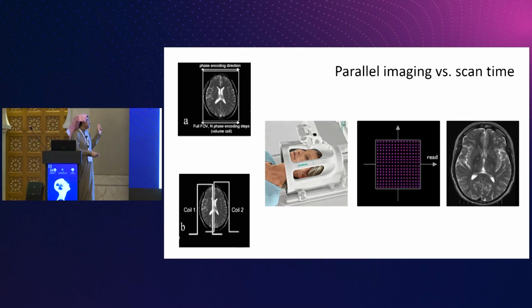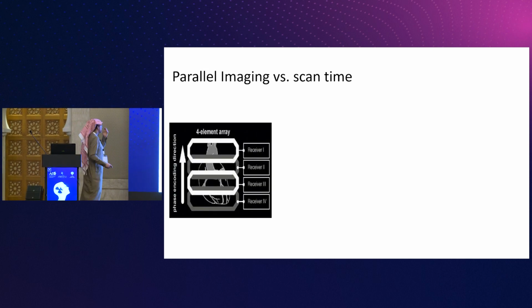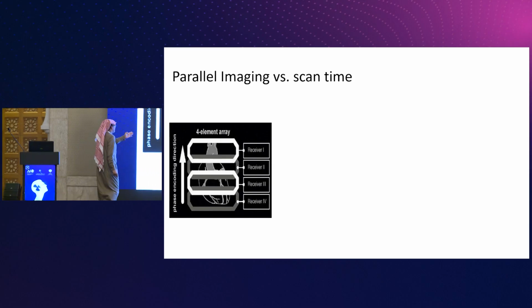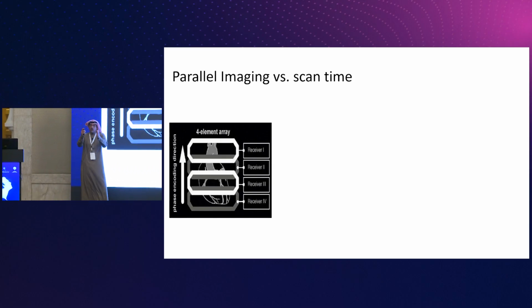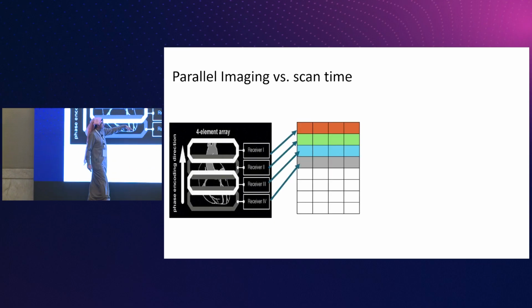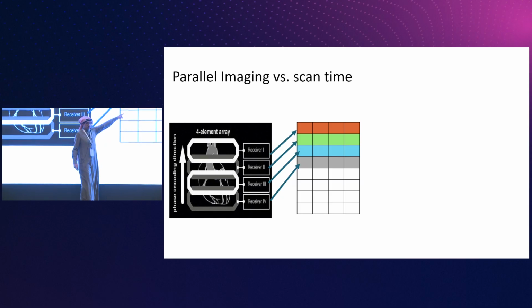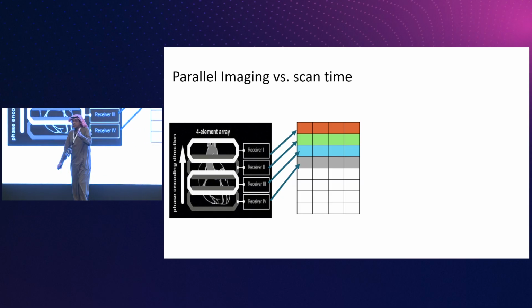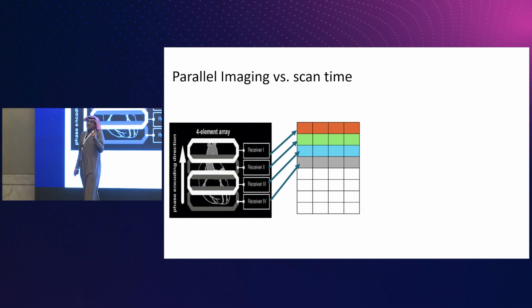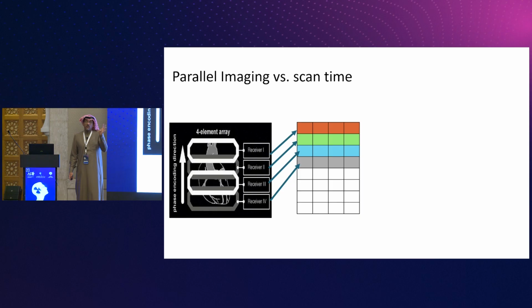So k-space fills two lines together. You will see it here in the next. In cardiac imaging, they use 4 as the accelerating factor. So you divide the coil to 4 portions. Each portion gets a signal and fills k-space. So let us assume that each line needs 1 second to fill the line. Okay, so you need 4 seconds. But with parallel imaging, 4 lines with 1 second.